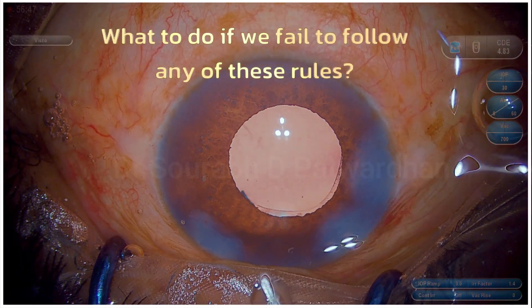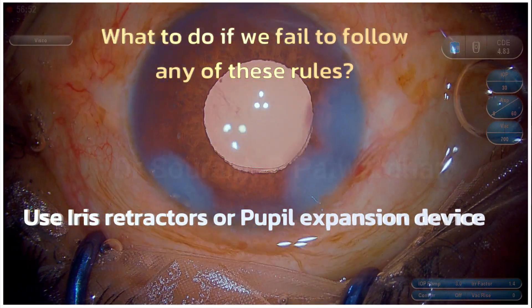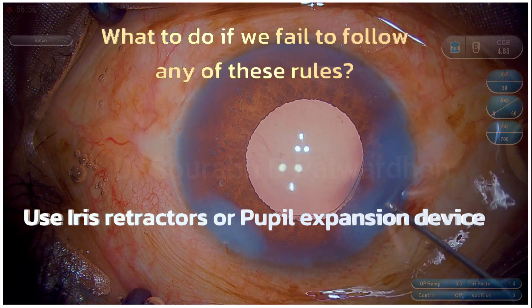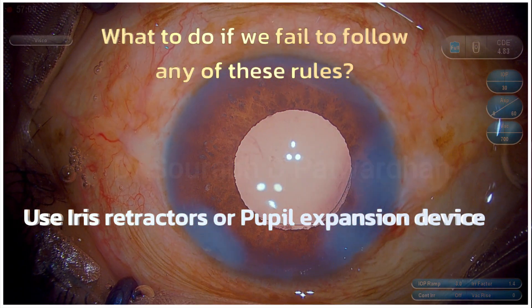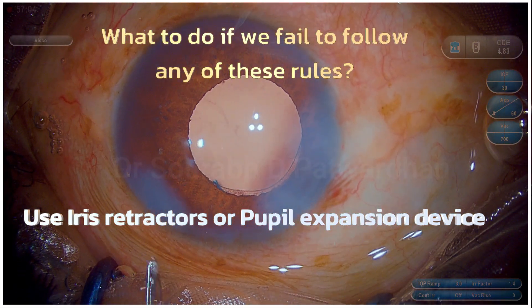If you fail to follow any of these rules — from rule 1 to rule 7 — just pause and use iris retractors or a pupil expansion device, then go ahead with the surgery. These are the golden rules you must follow while dealing with mid-dilated pupil cataract surgery. Thank you so much.